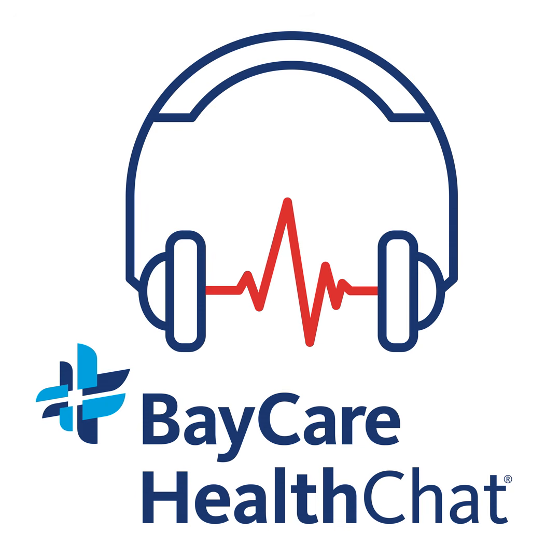Yeah. Well, doctor, before I let you go, is there any last message you want to make sure that people connect with when we're talking about this photon and proton therapy? Sure, Carl. I think just to summarize, for me, the take home points are proton therapy typically does not improve the cure rate of the cancer, and its main advantage is reducing the side effects and especially the long term risk that can occur when cancer is close to vital organs.